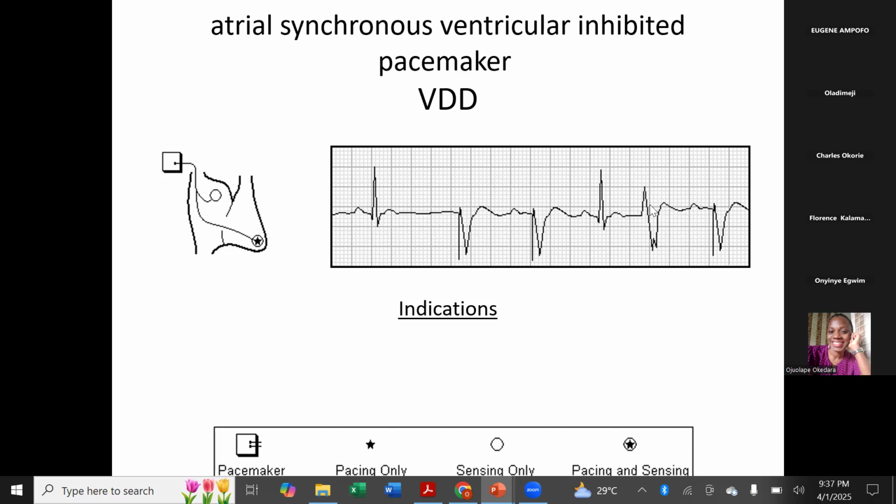In number 5, so patient can have VPC, right? Because a patient can have VPC for any reason. So if you have a VPC, the pacemaker should have ability to sense it, right? And not pace on a VPC. Okay, yes. So that's why you saw that interval and the next.